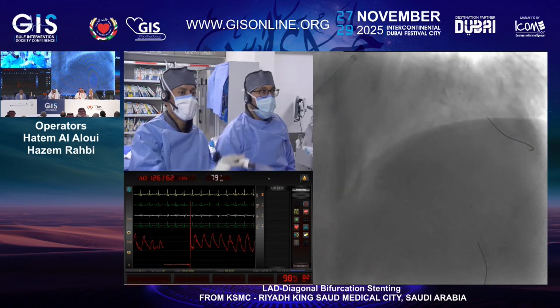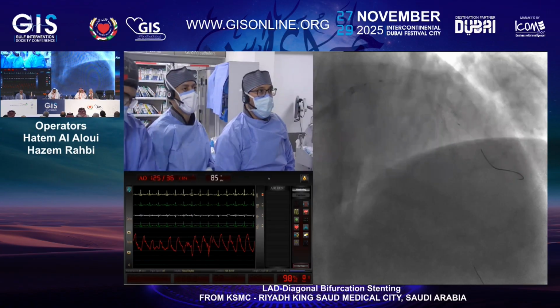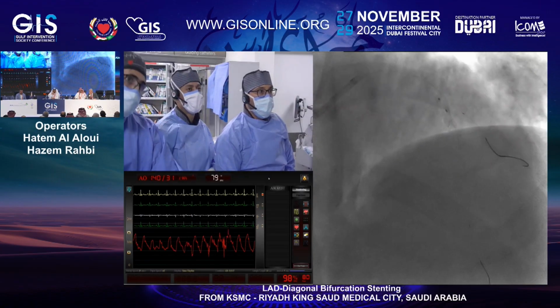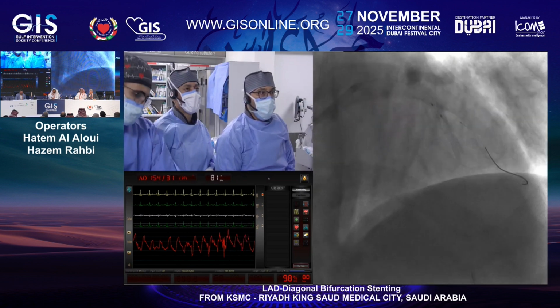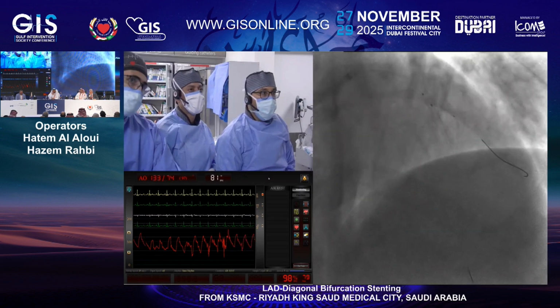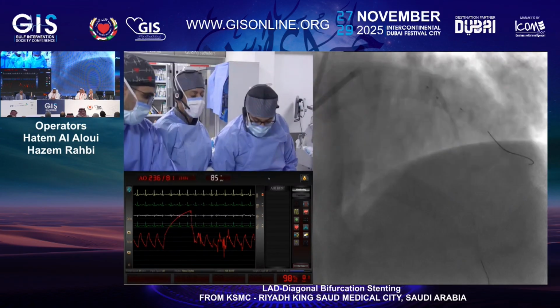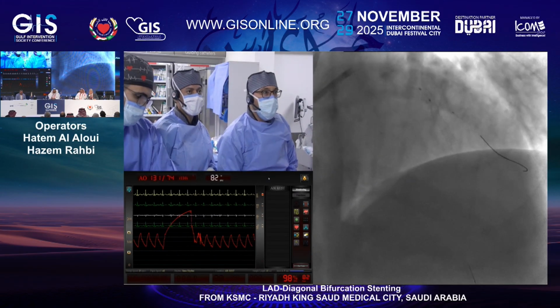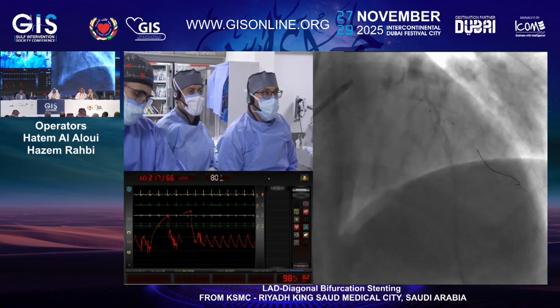I have the wire. Be ready. So it's very important to position the balloon appropriately here. What balloon is it? 4.0 by 8. It's a Sapphire. So we need to take into consideration the shoulder of the balloon.